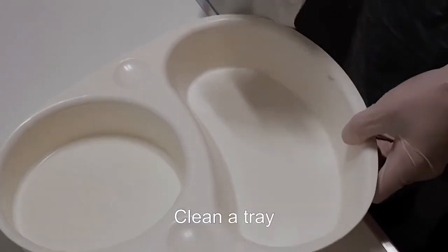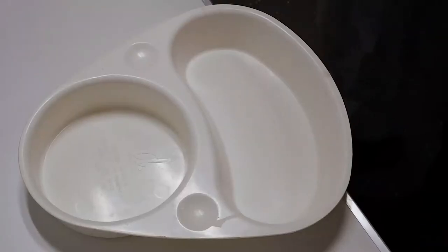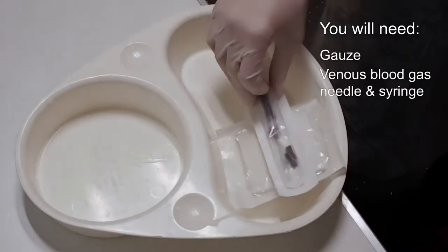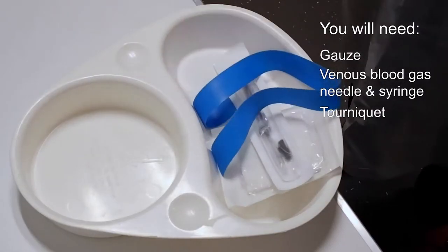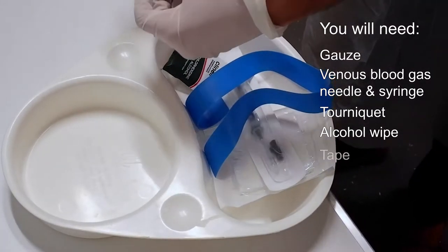Clean a tray with an alcohol wipe — first on the inside, then on the outside. You will need: gauze, a venous blood gas needle and syringe, a tourniquet, an alcohol wipe, and tape.